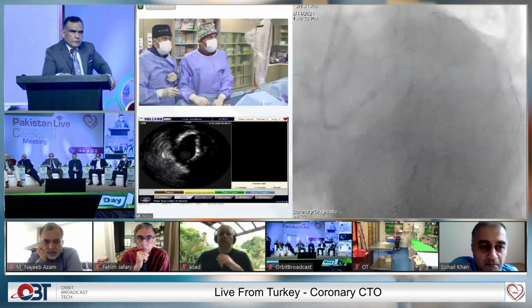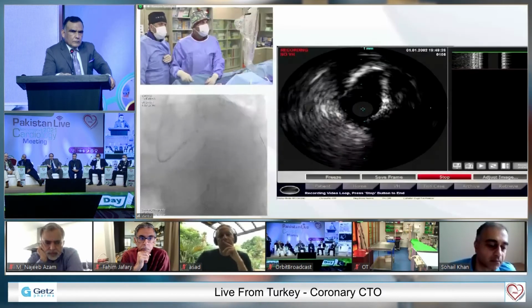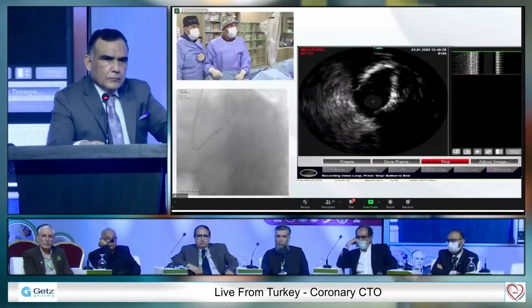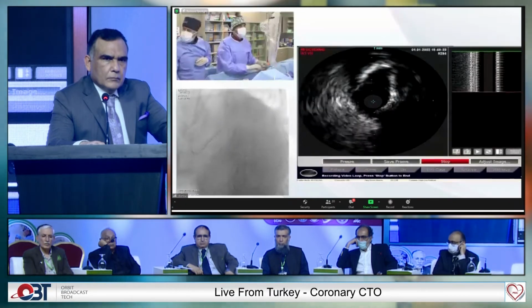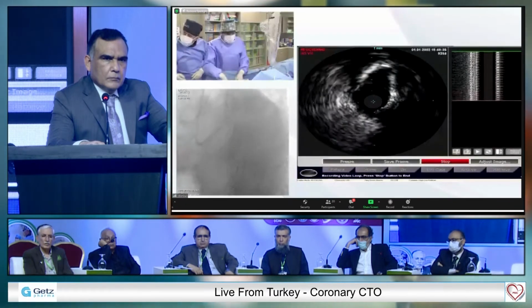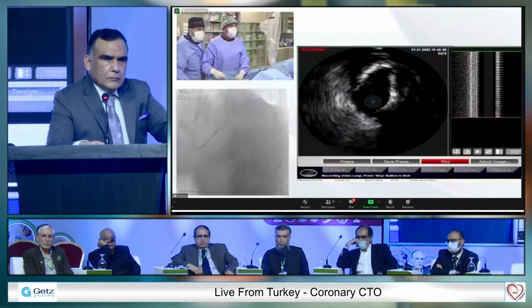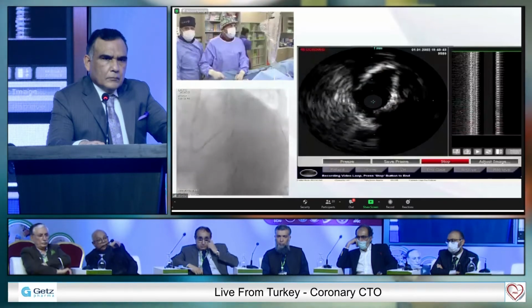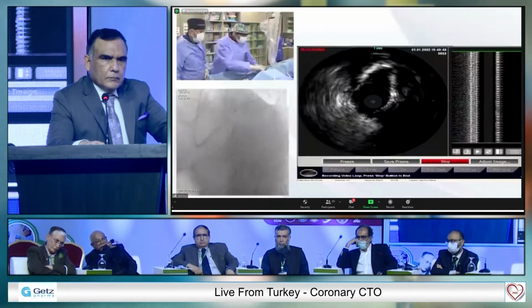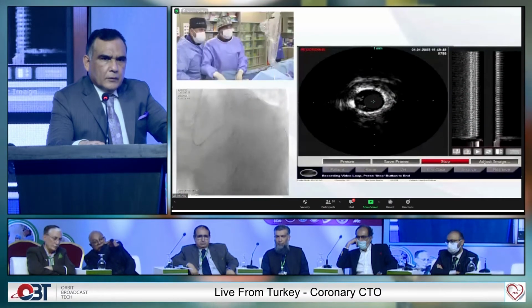First of all, what I'm thinking, I could do many things, to be honest. But let's do, for penetration, I have a side branch. For penetration, let's use Conquest 9. It will be better for puncture, especially if you have a side branch like this. Let's remove.